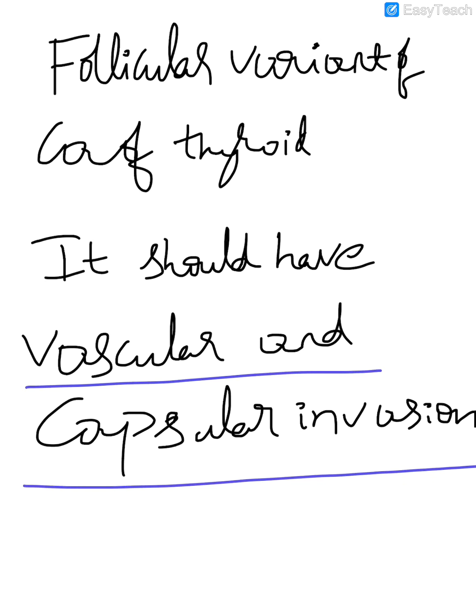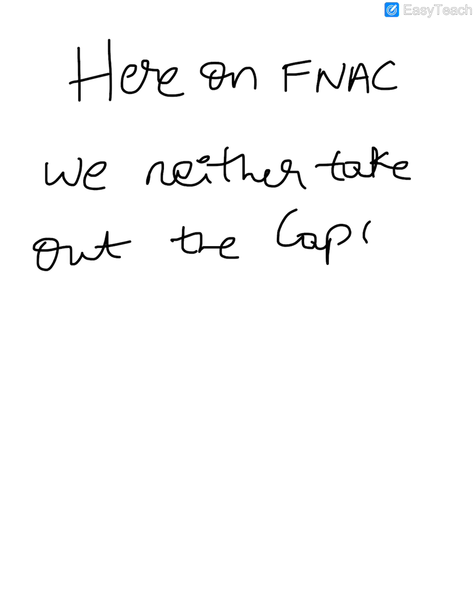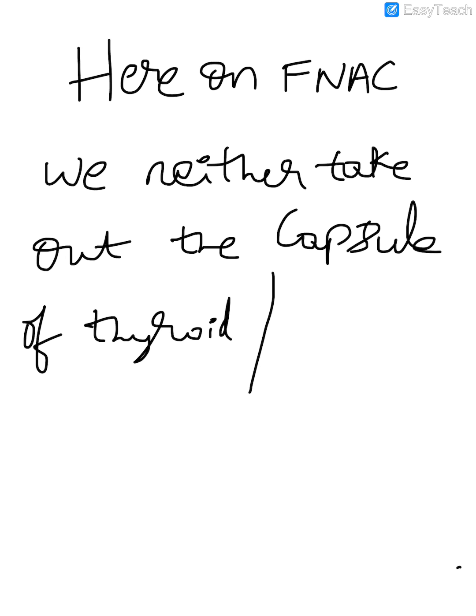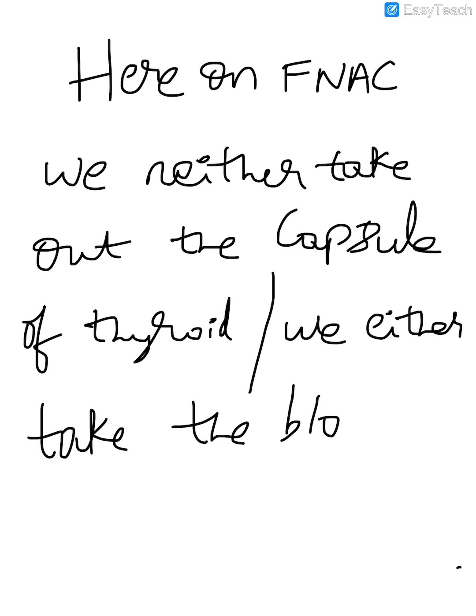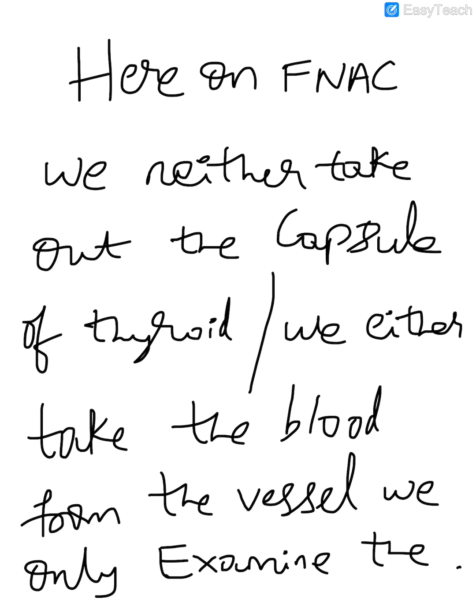So here on FNAC, we neither aspirate the capsule of the thyroid, nor take blood from the vessel; we only examine the thyroid follicular cells.